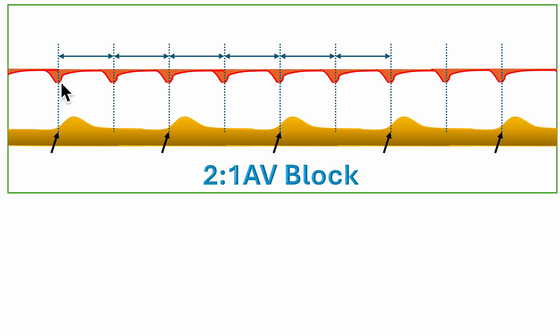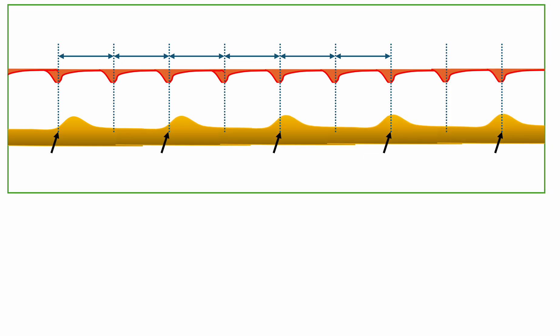The hallmark of 2:1 AV block, and how you differentiate it from complete heart block, is that the coupling interval between the atrial contraction and the ventricular contraction is exactly the same. Look at the atrial contraction falling at exactly the same place on each alternate beat relative to the ventricular complexes — the atrium is connected to the ventricle. In complete heart block, the atrial contraction falls at a different time relative to the ventricular contraction each beat, indicating that the atria and ventricles are not associated with each other.